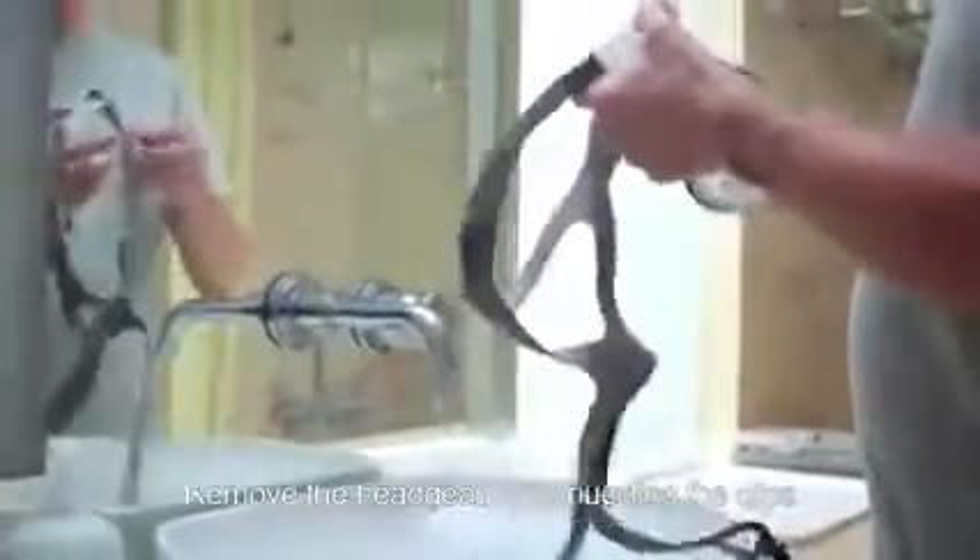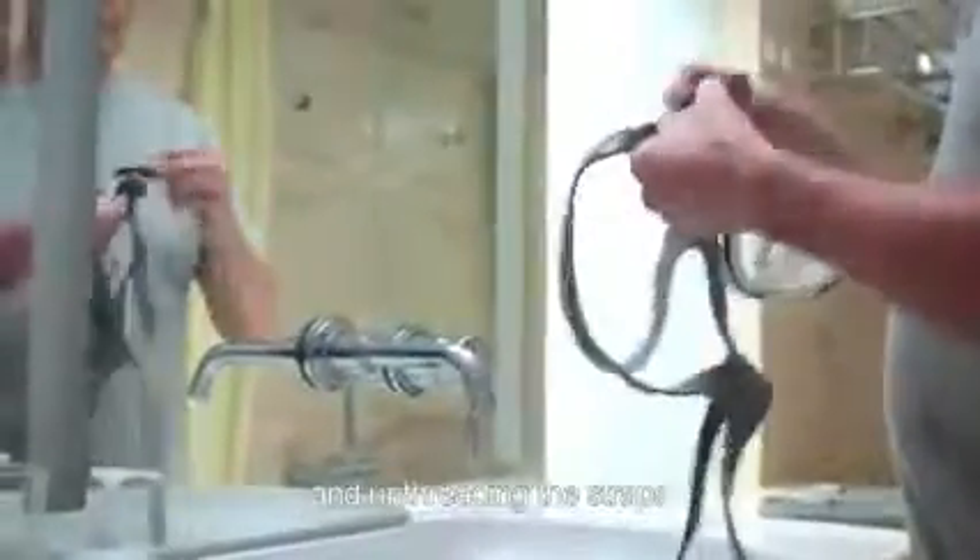Cleaning: Please clean your mask regularly. Remove the headgear by unbuckling the clips and unthreading the straps. Separate the cushion from the cushion frame. Hand wash the mask in warm water.